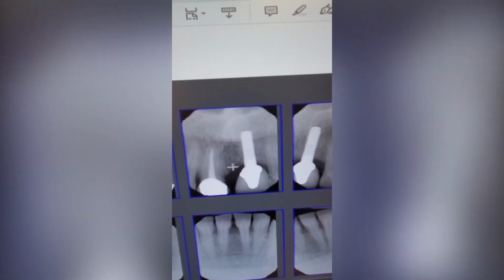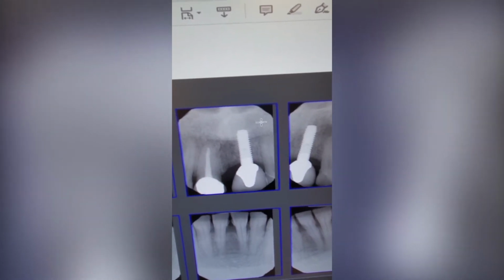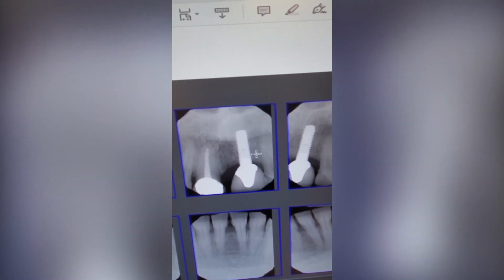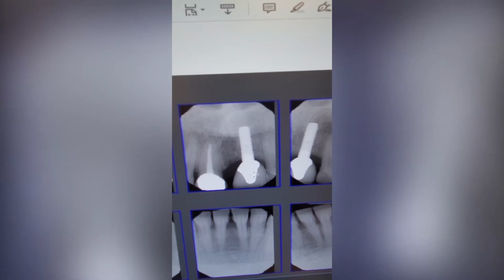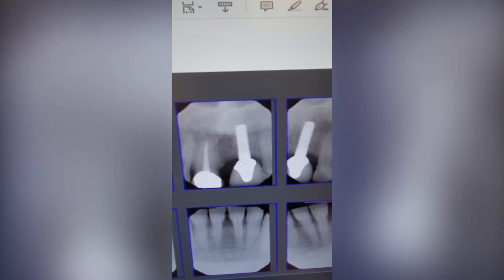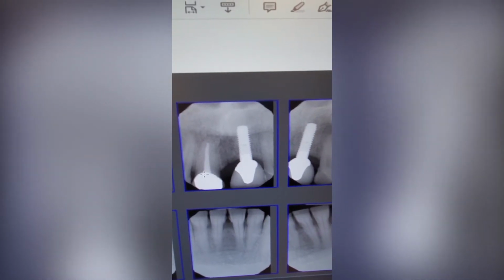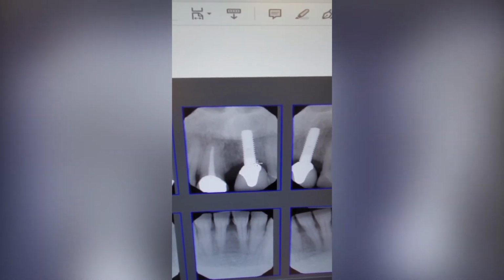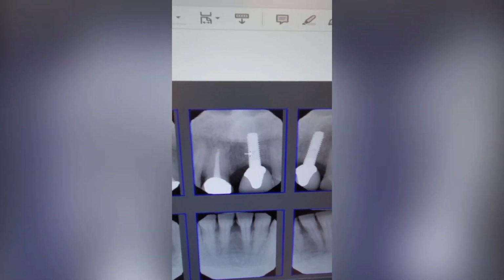What we decided to do, which is more predictable, is to make a cut in the bone around the dental implant, moving the bone and the implant up more coronal. First, we took this tooth and made it the same length as the tooth next door, and then made a plastic guide or stent that sat on the other teeth, so that when we pulled this down, we just wired that into the splint, keeping it moved in a vertical direction.